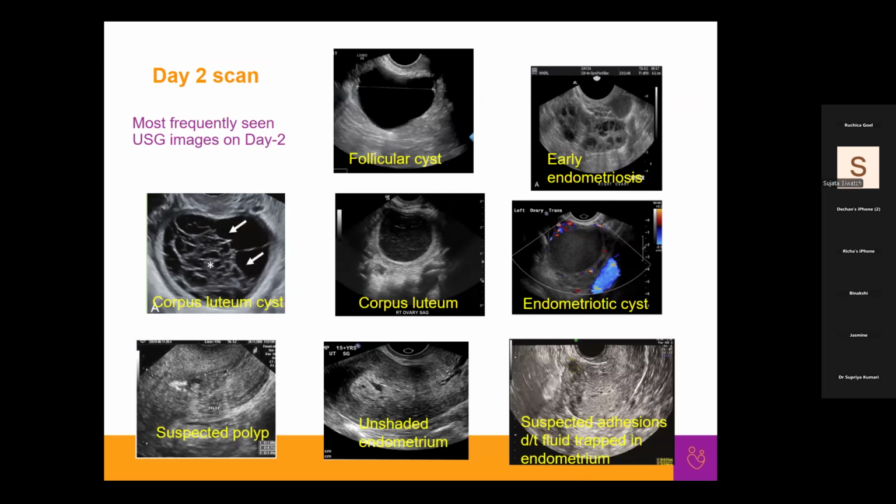See, a single diameter could not give you the exact bulk of the stroma, or the exact number of the antral follicle count. So it is always a wise idea to get a volume. Volume is basically a three-dimensional measurement, so it gives you a better idea of how bulky the ovary is and how the antral follicles are distributed around the stroma. That gives you a better picture than taking a diameter in one view only.